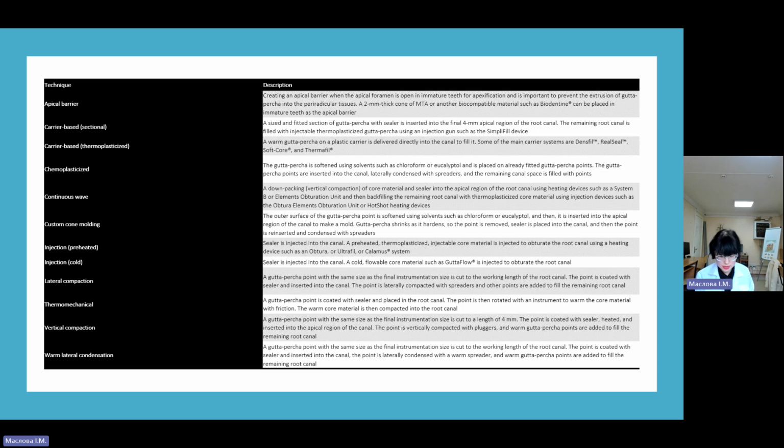Almost all endodontic materials can discolor teeth, so it is unlikely that many sealers will guarantee color stability in a root-filled tooth. This emphasizes the need to terminate the root fill well clear of the clinical crown, protected with an orifice barrier, and to carefully clean the excess from the cavity before placement of the final coronal restoration.